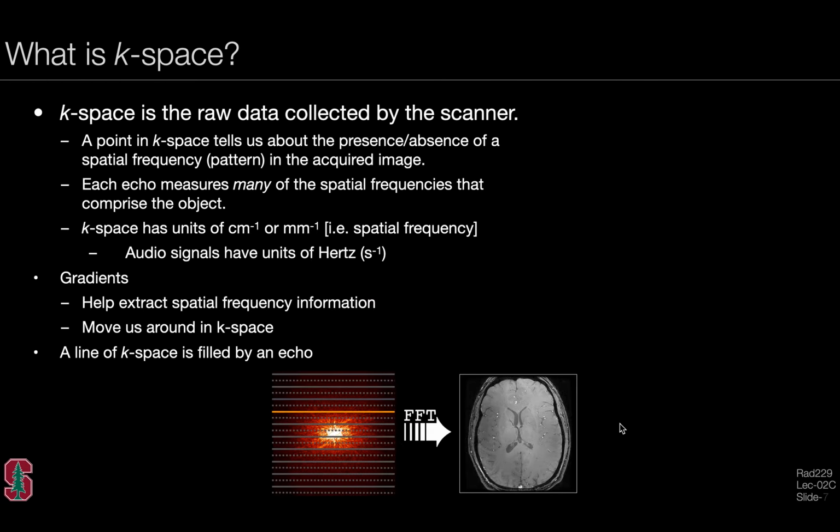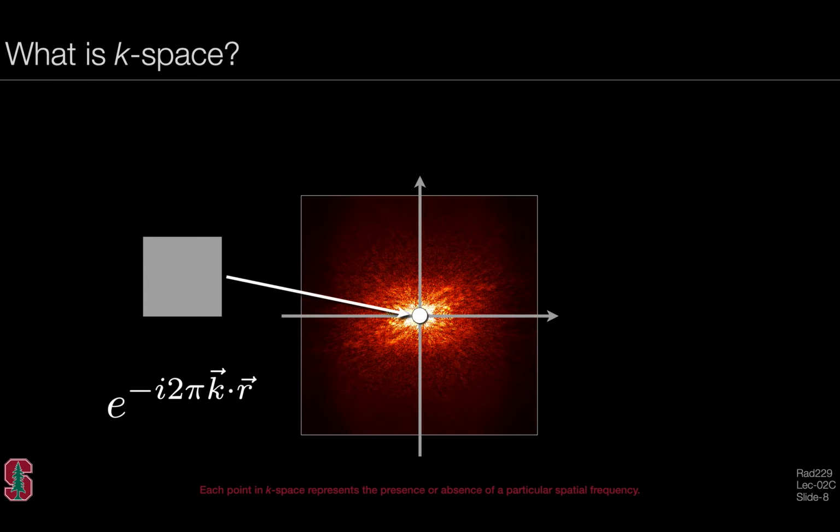We can answer the question, what is K-space, another way? Here we are identifying the image information associated with the middle or central point of K-space, and we see that it would represent DC, or very flat image information.